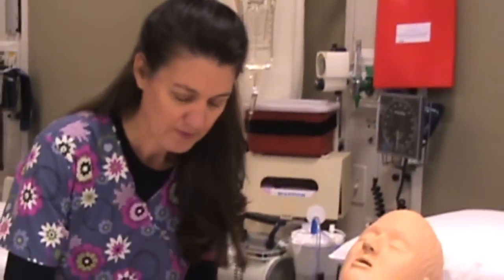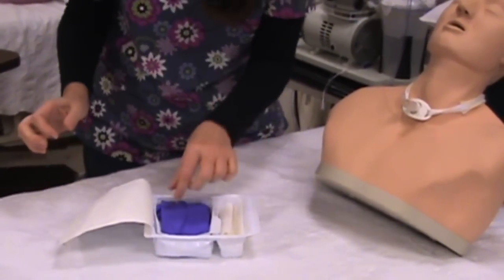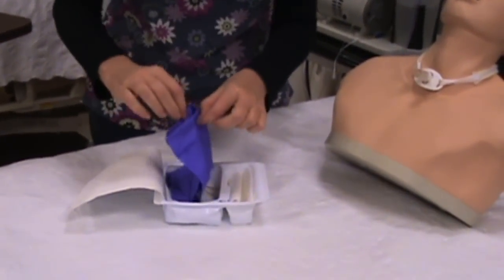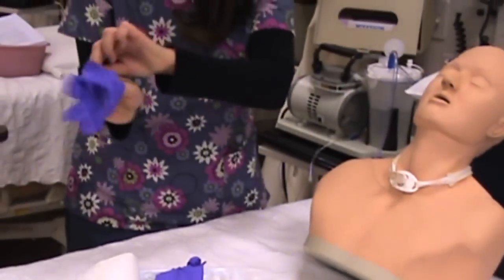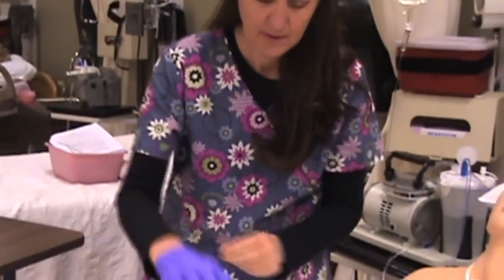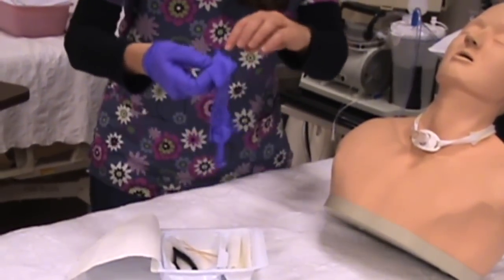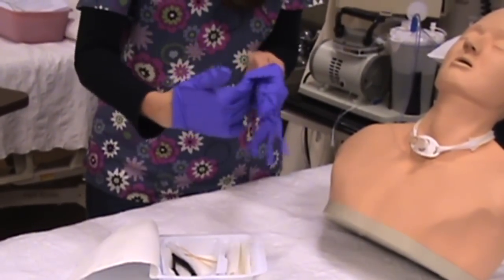Then I can open up my kit right here, and I have a pair of sterile gloves. Remember, you always want to put them on where your hand is pointing up, and we'll put this other one on under the cuff.